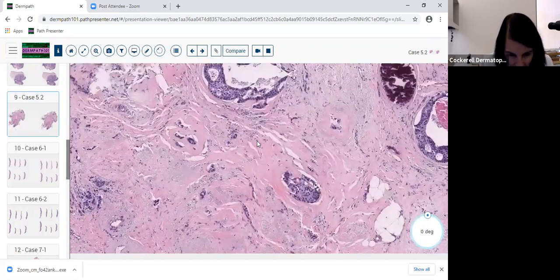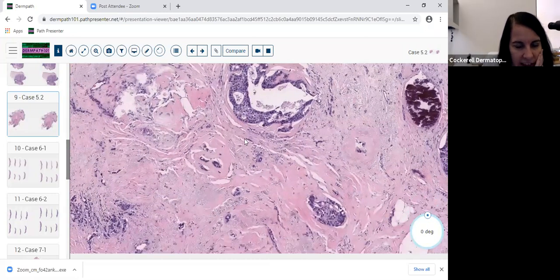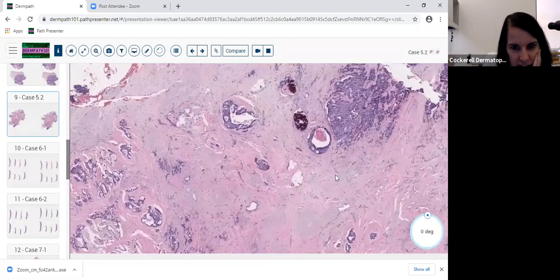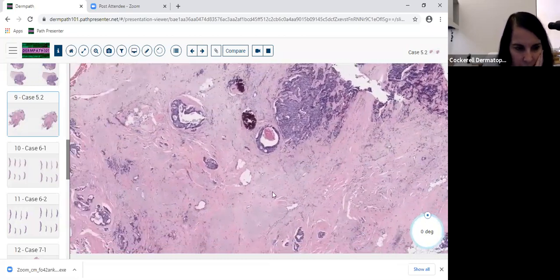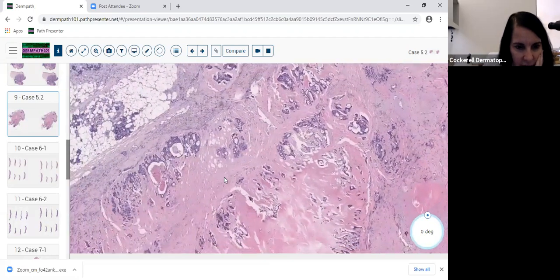It's infiltrating in this area, but it's mimicking the ductal carcinoma in situ, almost a comedo or cribriform type. So that's a reason that when you looked at the second slide, you're like, oh, this is breast for sure. And if you've seen enough breast cancer cases, it's very much looking like that.